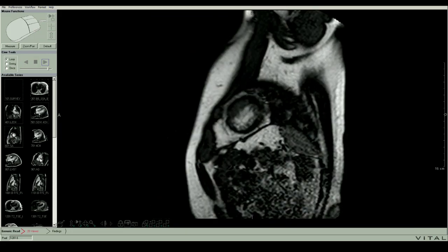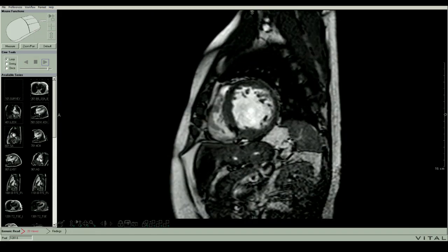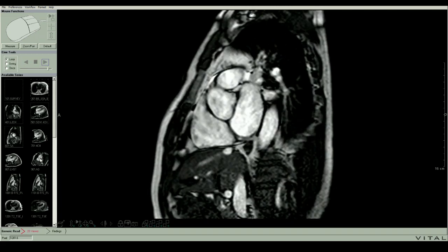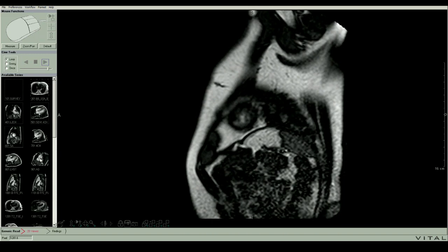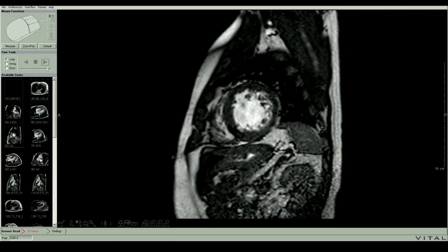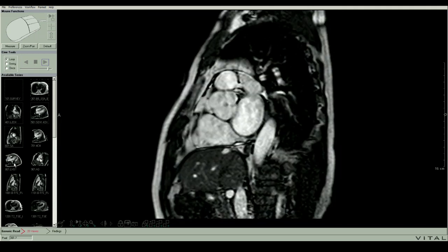What we see here is that there's something wrong with the twisting. The torsion isn't right at the apex. You always look at the first apical segments for torsion, which is counterclockwise as we see it here. So we're right here, we're looking for torsion. It's supposed to be counterclockwise. Something wrong with the torsion. It didn't move counterclockwise. And then there's some regional LV dysfunction. It still looks like about 40%.